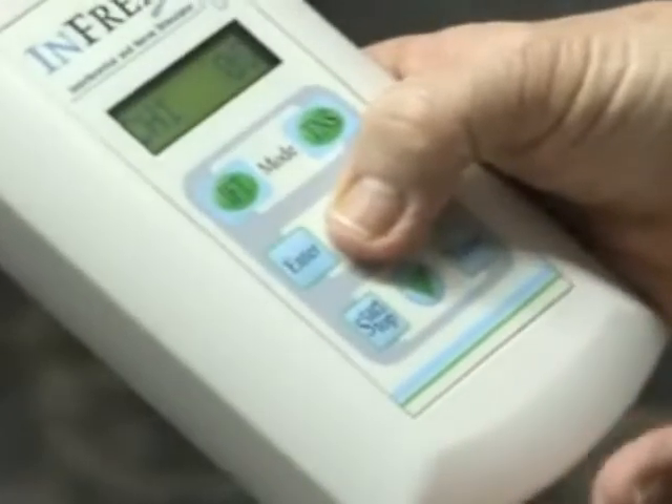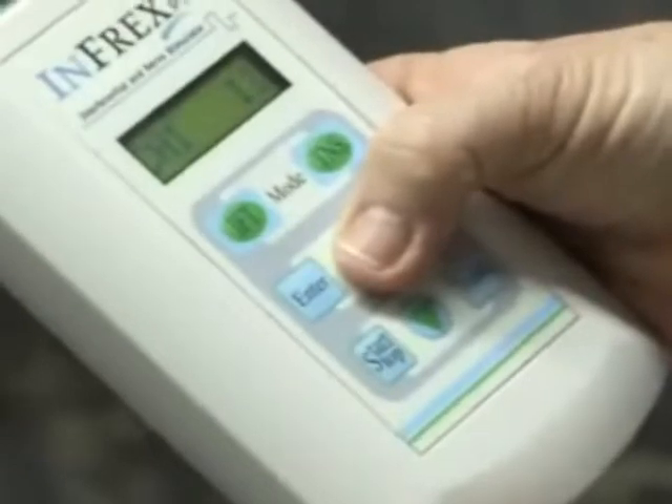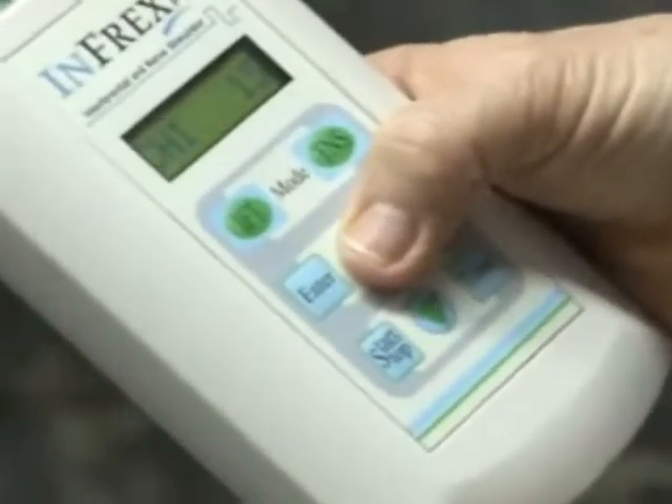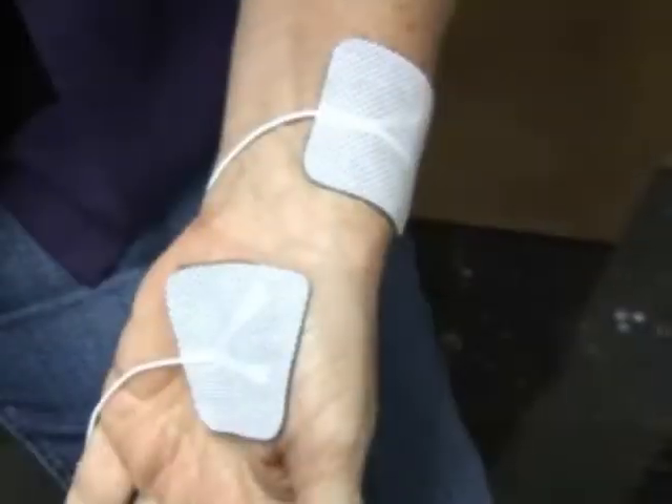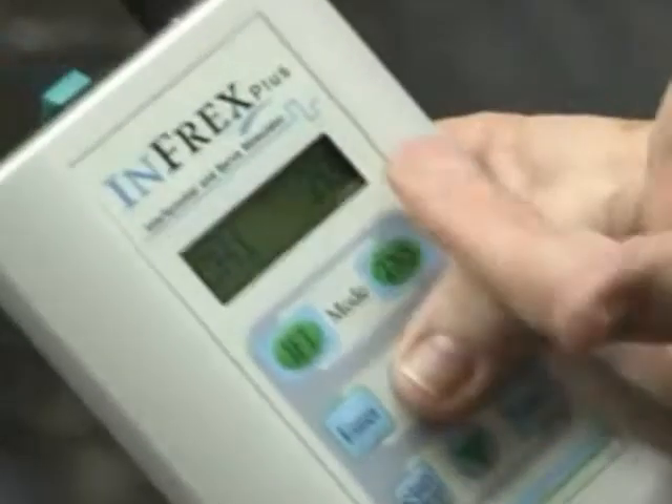You set the time, and now you have Channel 1. For Channel 1, you hit the arrow button and increase the intensity until you start to feel the electrodes — you want to feel it but keep it comfortable. Keep increasing until you can feel it. I'm feeling it now, and that would be number 20.